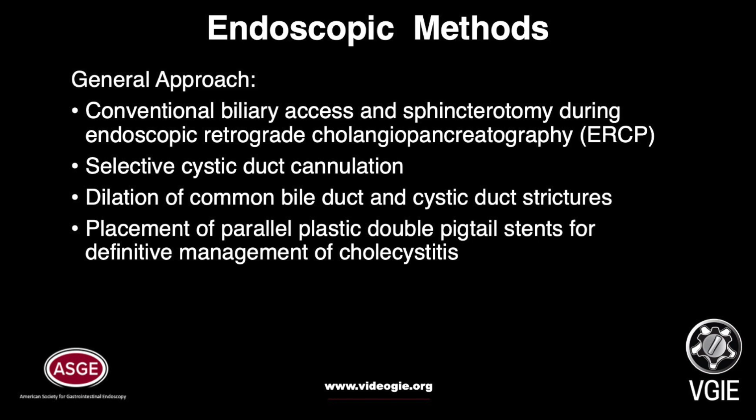The general steps for endoscopic Transpapillary Gallbladder Drainage include conventional biliary access and sphincterotomy during ERCP, followed by selective cystic duct cannulation, dilation of the common bile duct and cystic duct strictures, and placement of parallel double-pigtail plastic stents for definitive management of cholecystitis. In this video, we will outline our general approach to the procedure as well as highlight useful techniques for successful completion.